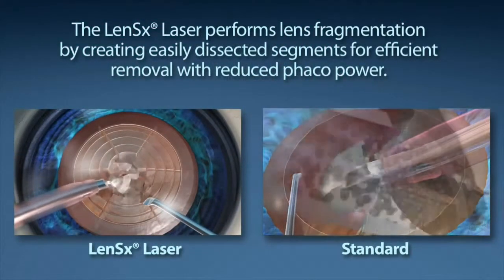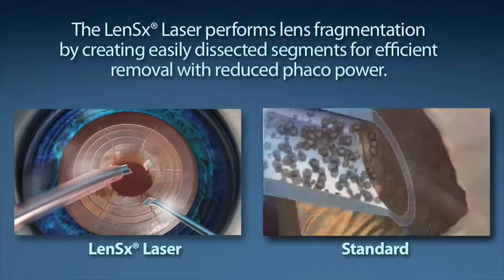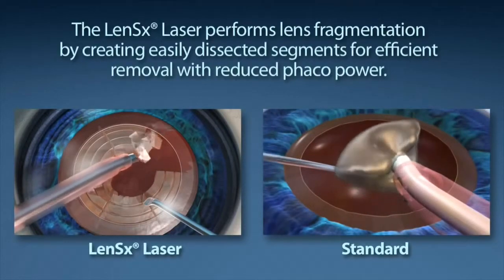Well, I remember the previous procedure, those pieces were fairly big. They're four big chunks. Yeah. When this, I saw briefly what it looked like, very small pieces, so I imagine it is a lot more efficient. A lot less energy. And of course, very precise with a laser. There is nothing as precise as a laser. Now, surgeons are well trained in cataract surgery.